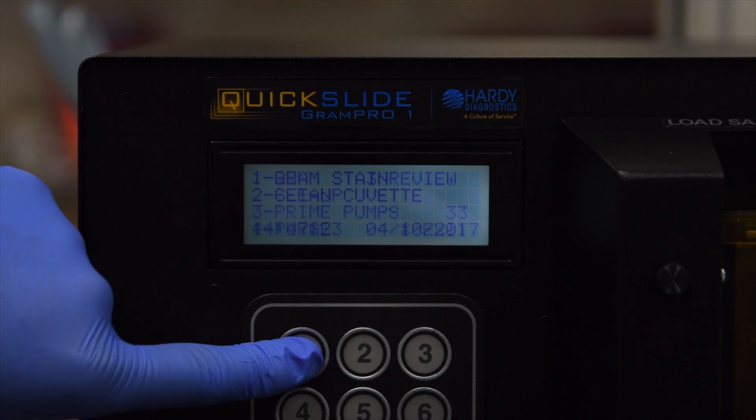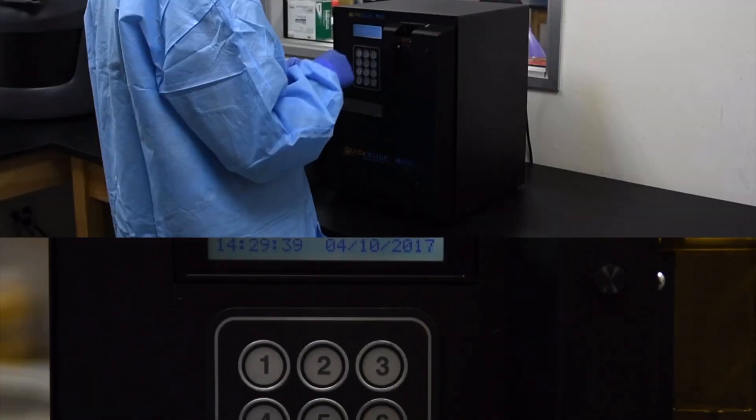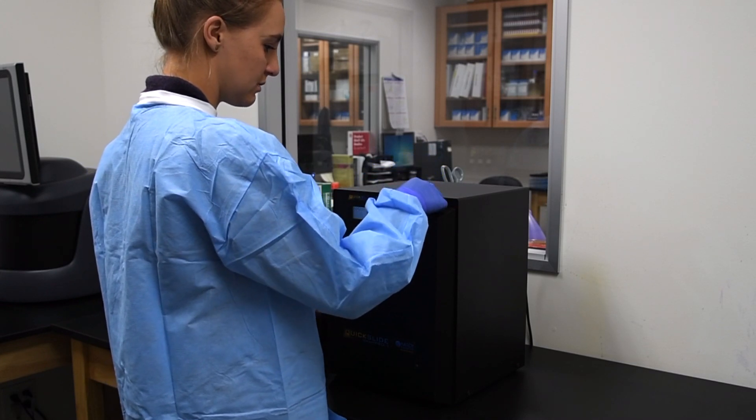Press 1 to select Run. Press 3 to select Prime. The GramPro 1 is now ready to run samples.